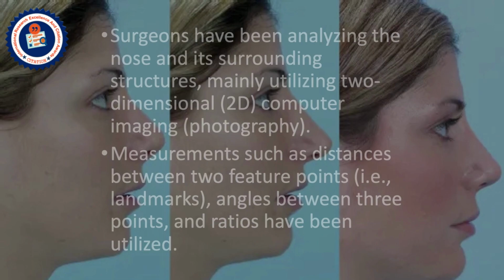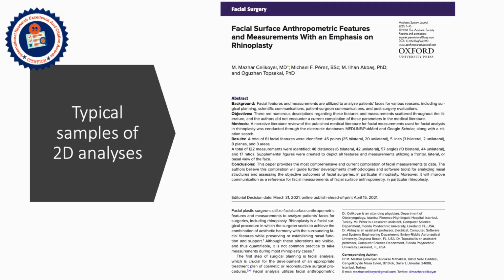Surgeons have been doing this analysis of the nose and the face mainly by utilizing two-dimensional computer imaging and photography. Measurements that they've been doing were distances between two feature points, angles between 3 points, and ratios were also being utilized.